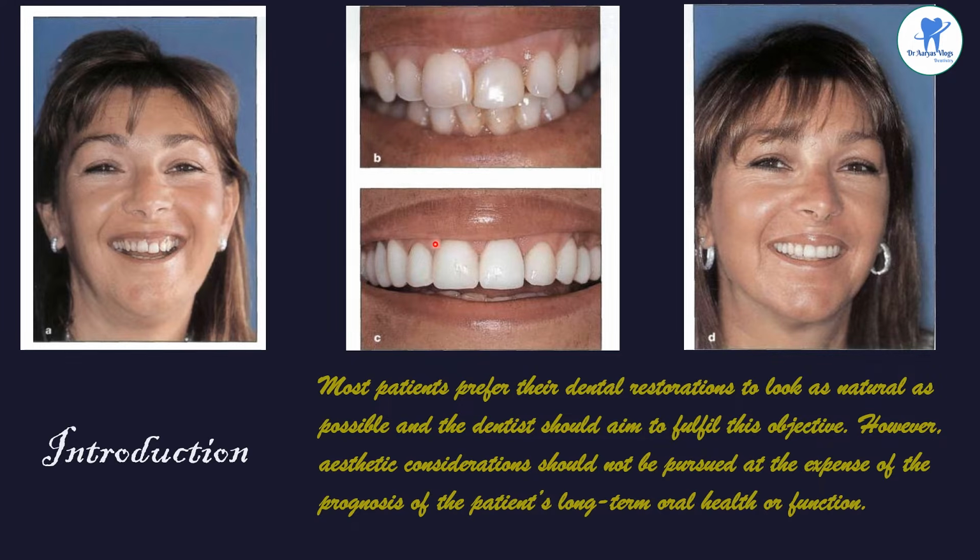It has been corrected in the new smile design. And the dark buccal corridors that were there are eliminated by slightly over-contoured porcelain laminate veneers placed on the premolars. Balance, symmetry and an improved arch form have been successfully achieved.